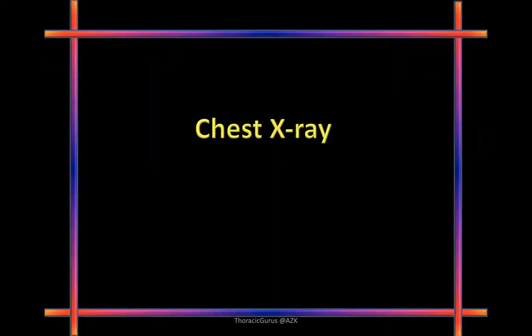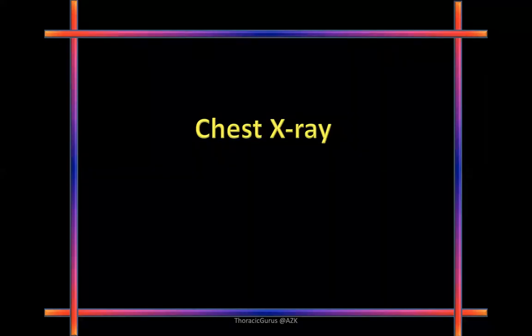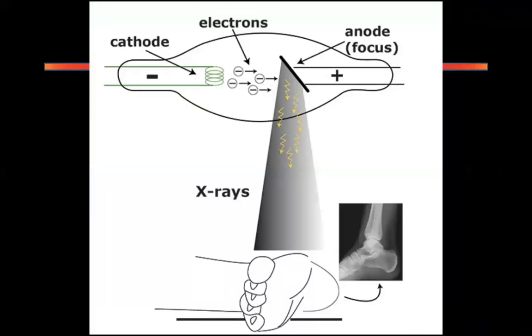Of course, in a pregnant lady, you don't want to expose people to CT scans, because the fetus doesn't like radiation exposure, and you can get fetal changes because of CT radiation. And in that scenario, MRI might be an answer when you're trying to analyze pathology in the patient, because MRI does not have radiation. It is magnetic field. It's a different technology, a different terminology, and I'll talk about it when I finish this talk.